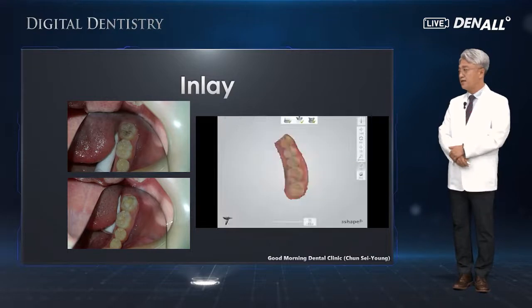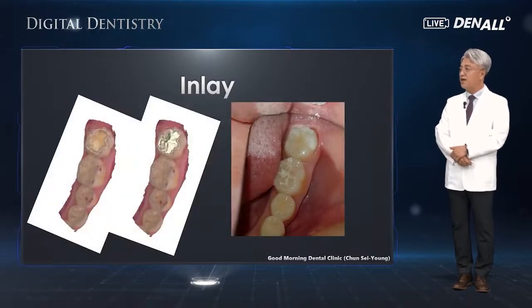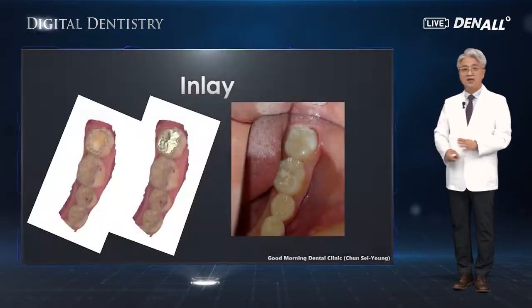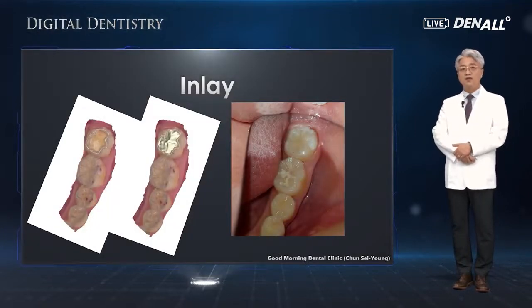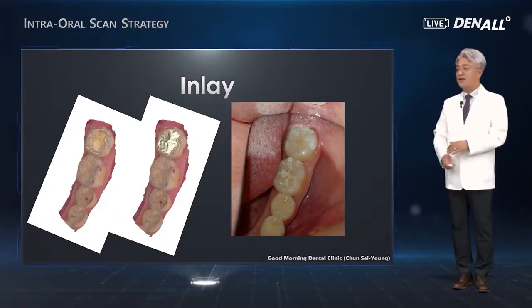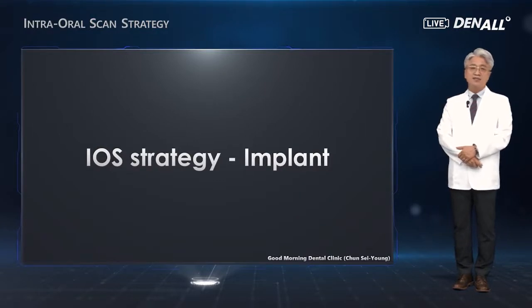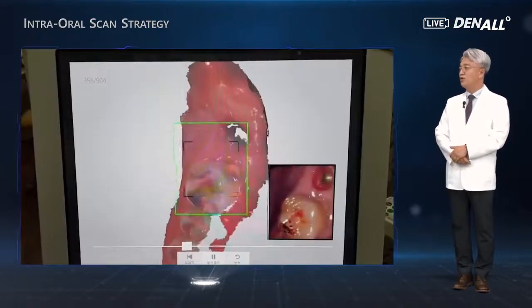You could do it very simply. This is the prosthesis design already done. It is delivered to a patient. When you adjust the setting values, you will be able to realize the prosthesis can be very precise using this way. Lastly, let's look at an implant case.